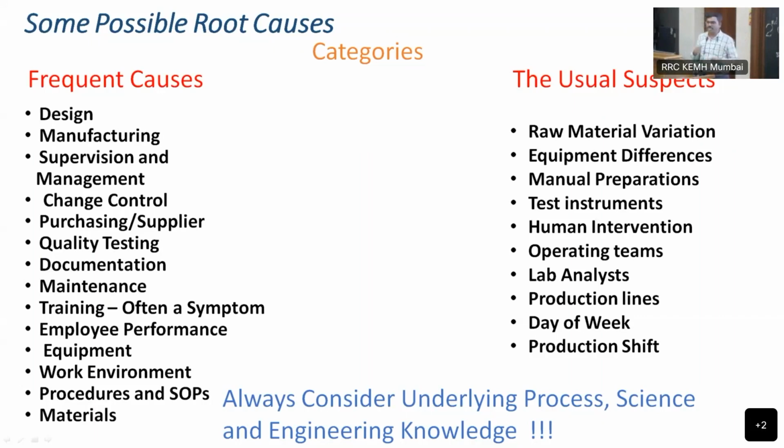Okay, documentation, SOP. Say for example, in my lab there is a photometric SOP, right? 1:2 dilution is recommended in validation. Okay, we know validation and verification. Verification means what? Whatever performance claims of the manufacturer is there, we have to verify it. Suppose they said 1:2 is the recommended dilution. Beyond that we should not do that, otherwise you will have sort of error.